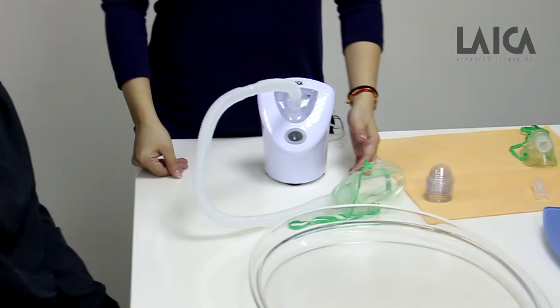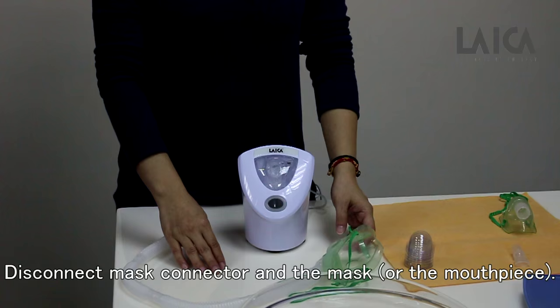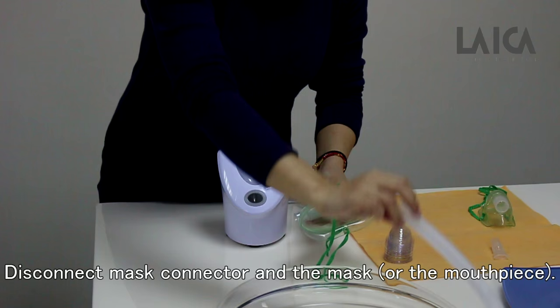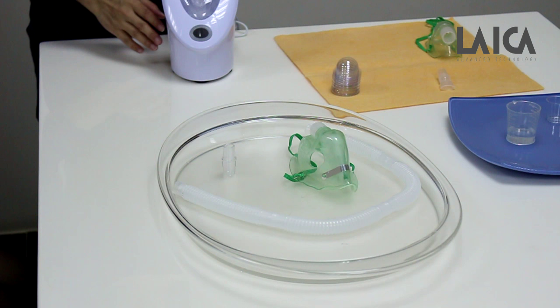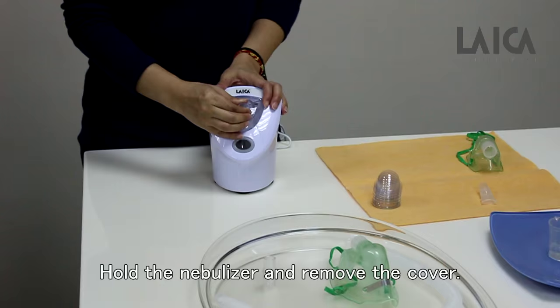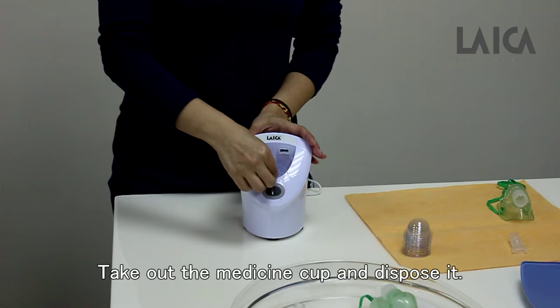Disconnect air connection tube from the cover. Disconnect mask connector and the mask. Hold the nebulizer and remove the cover. Take out the medicine cup and dispose it.